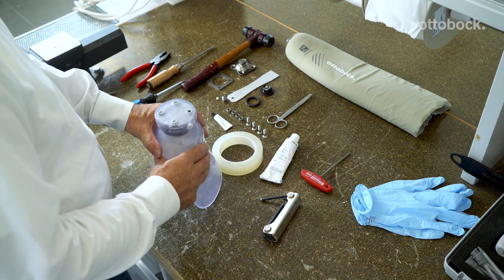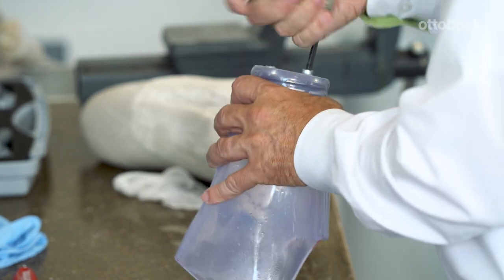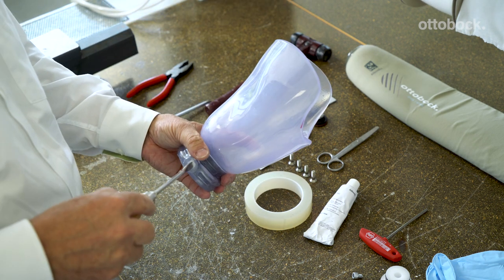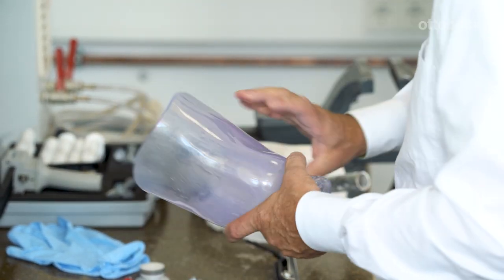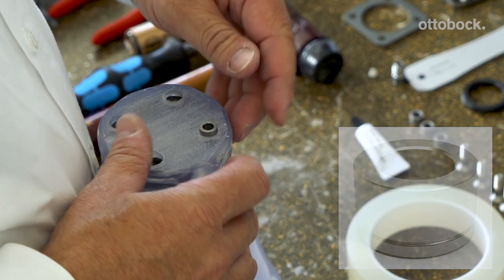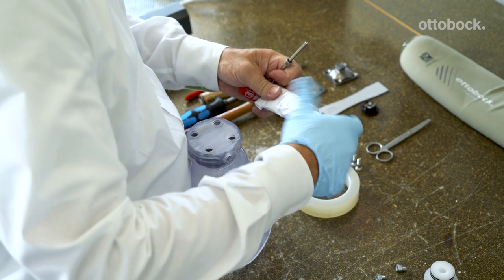To prepare the distal end of the DVS socket to receive the components, the surface is ground flat to expose the top of the cap screws. The important part is to grind until just contacting the metal of the cap screws. Next, remove the valve dummies and insert the snap bushings. The snap bushings are slightly conical, so the ring you see on one end needs to be inserted first. Apply a silicone bonding agent on the outside of the snap bushings to ensure an airtight socket.